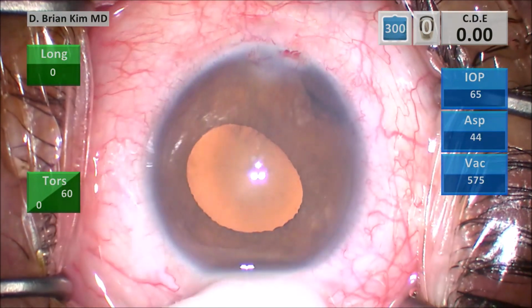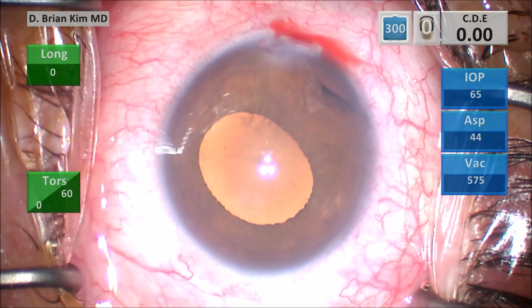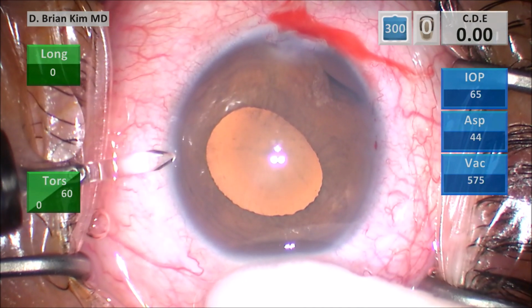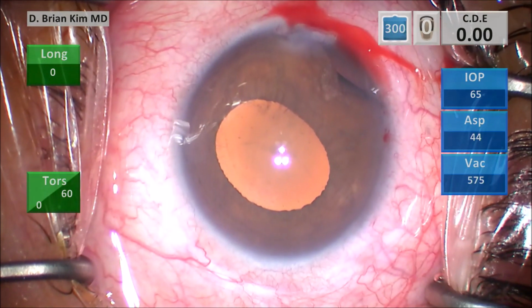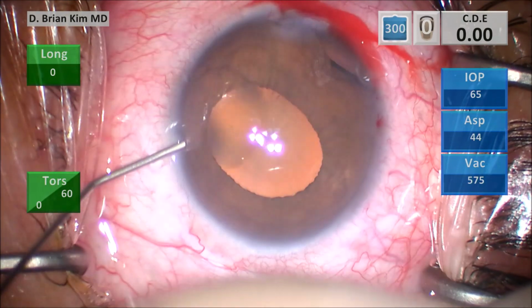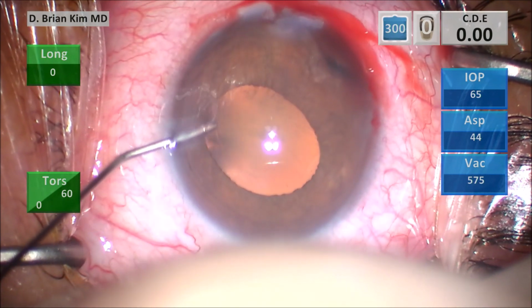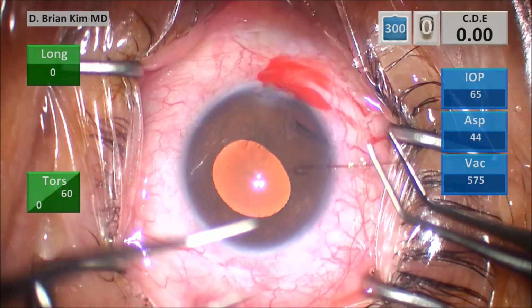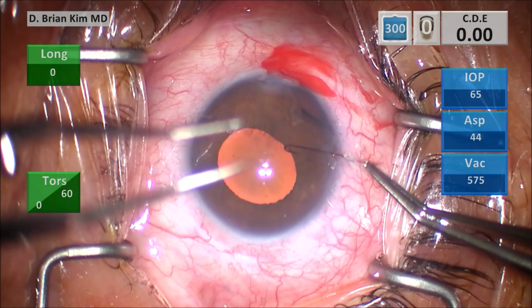Now remember, I wanted to retract that pupil for 2 reasons: to be able to take the cataract out, but also, in case there is vitreous in that area, I want to be able to tamponade that vitreous away. By retracting that pupil, it will temporarily close that iridodialysis and minimize any vitreous prolapse. This is some intracameral epinephrine. You can see using a 2-handed technique, you can just twirl the hook down once you get it into the eye and then pull the stopper down to cinch it down.